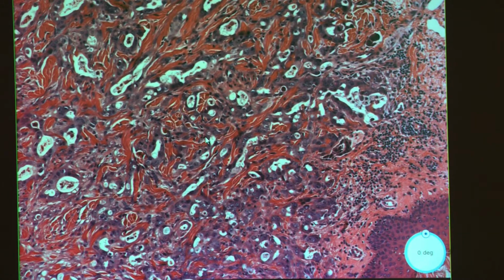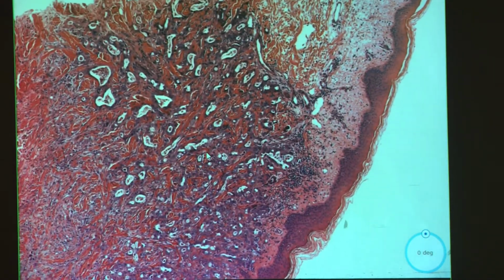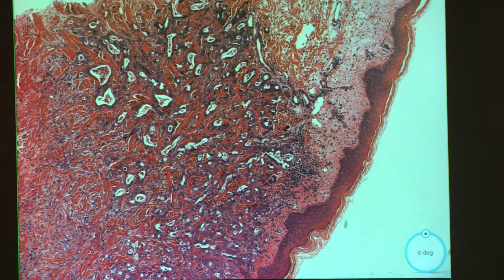this is a metastasis. So you don't have any pathology, but this patient has a history of a partial esophagectomy 10 years ago. Okay, so partial esophagectomy for cancer probably? Most likely. So that would be the number one suspicion. And we will throw some stains to confirm your suspicion. Esophageal stains. Actually, I don't know esophageal stains. What do we have here?